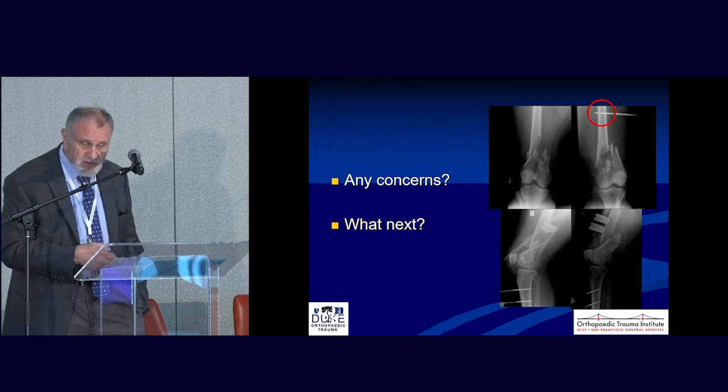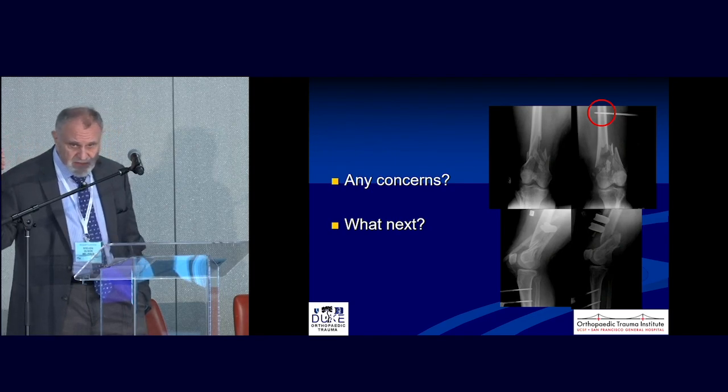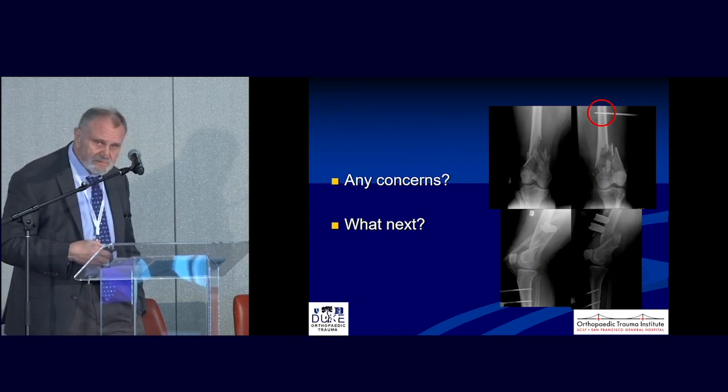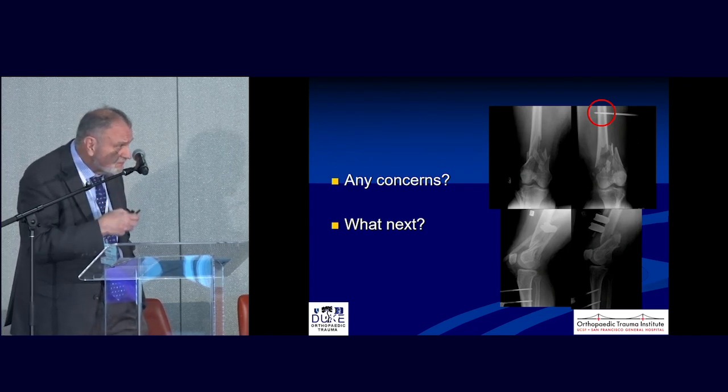So if you choose, I put two parallel. Right, so if you choose to use a plate laterally, it won't be in your way, or if you choose to use a distractor in the operating room, you can do that. The OR as a distractor too. Right. Those are good points. Those are kind of anteromedial, but it's not so much different.